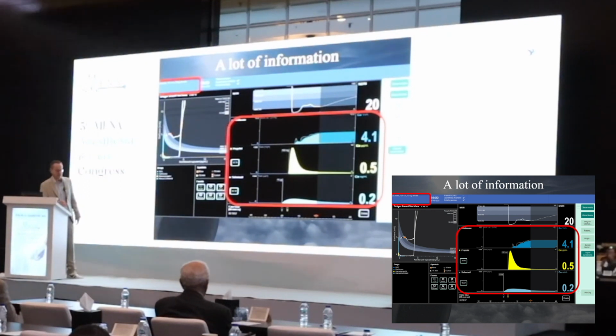Then we have, like we see here, the end-tidal concentration of our inhaled anesthetic. This comes from the anesthesia workstation because the SmartPilot View is connected to your anesthesia machine. If you were to use syringe drivers, they would also be connected to your SmartPilot View, and then you would have their information also transmitted to the screen of the SmartPilot View.